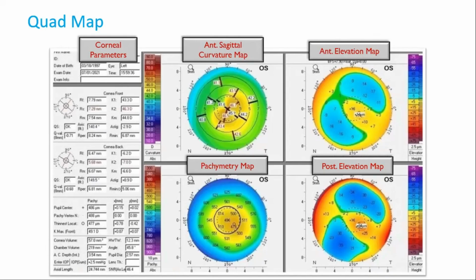Yes. So see, that makes it ideal for capturing very flat corneas or very steep corneas like keratoconus, where it can go beyond 60 or 65 or 70 for the keratometry, and also for flat corneas like post-RK, where your K is maybe as low as 21 or 22, right? Which we don't get captures on optical biometers, and maybe even on topography, we are not getting.